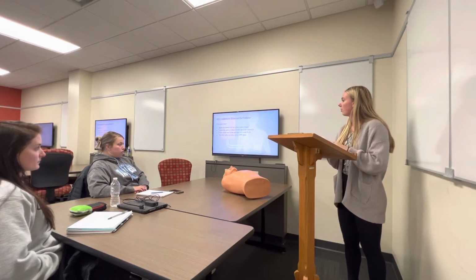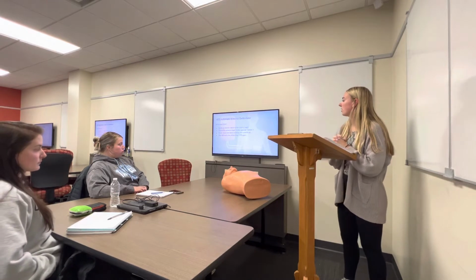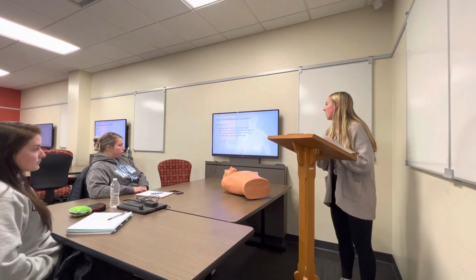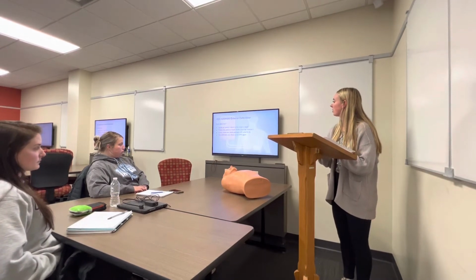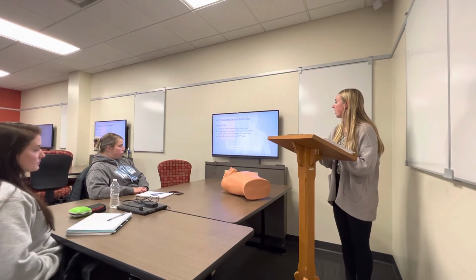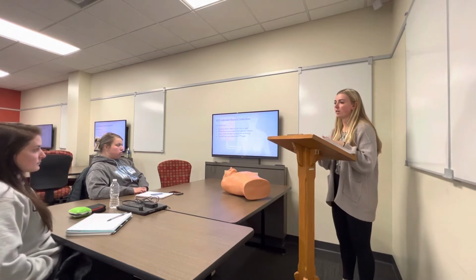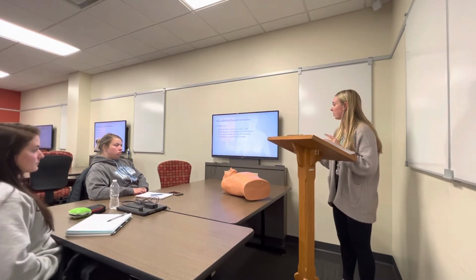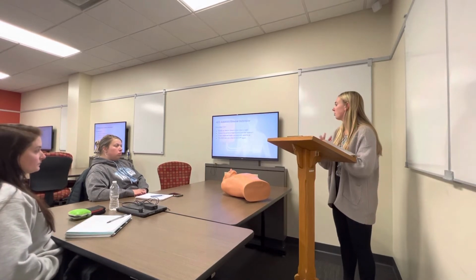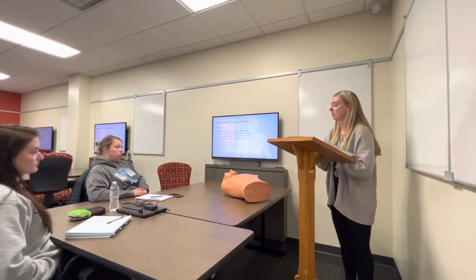And then what is an AED? So an AED is an automatic external defibrillator, and what does it do? It sends an electric shock to the victim's heart. It tracks the person's heart rhythm and can restore the heart rhythm. And then an AED gives visual and audio prompts with what to do. So the AED will actually have pictures on it that show where to place the pads, and it will tell you exactly what to do when the shock is advised, when to start CPR. And yeah, the AED tells you when to do CPR again.